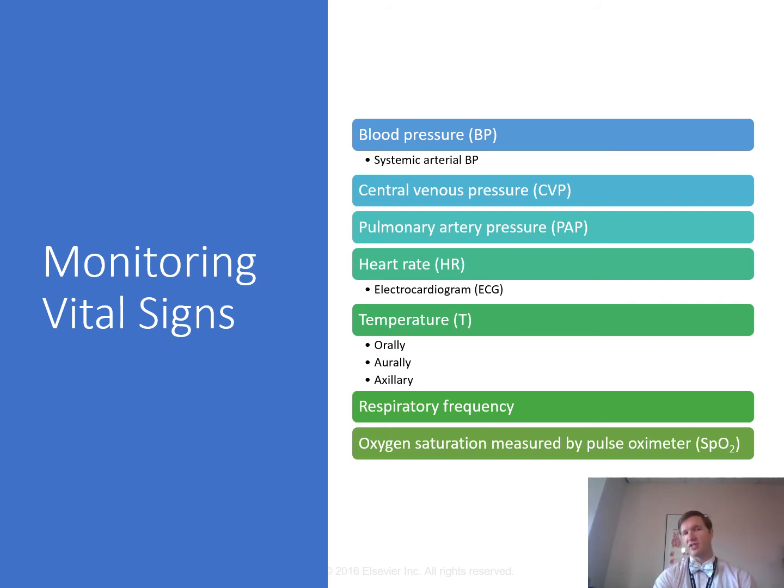What about blood pressure? Patients' blood pressure should be checked intermittently with the stethoscope, so manually, or an automatic blood pressure cuff. It can be measured continuously with an indwelling arterial catheter, an arterial line, but invasive arterial pressure monitoring is very, very commonly used after open heart surgery for really critical patients. And it can give you continuous measurements of blood pressure.